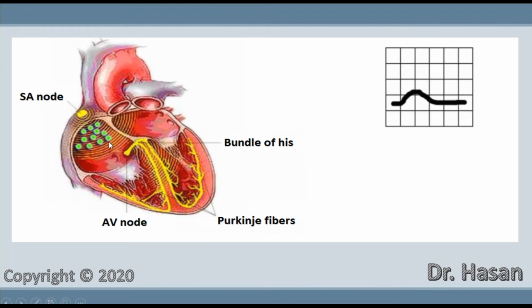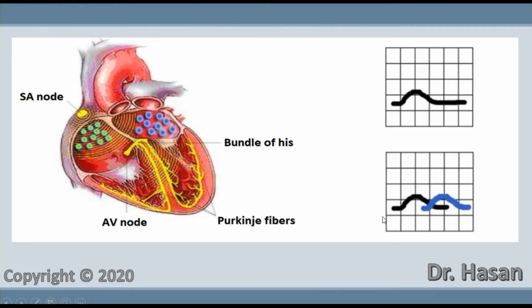Further, from the right atrium, an excitation pulse is transmitted through the interatrial bundle to the left atrium and also excites it. In the figure, these are the blue circles. Graphically, this can be represented by the second wave, the blue wave, which also has its own peak. In other words, maximum height. This is the excitement of the left atrium.